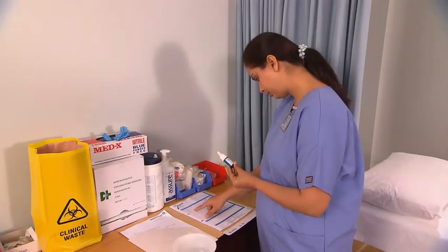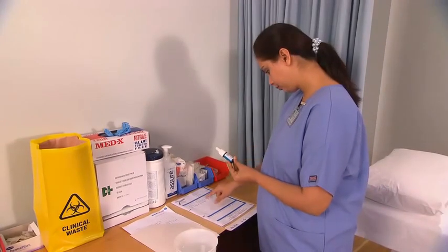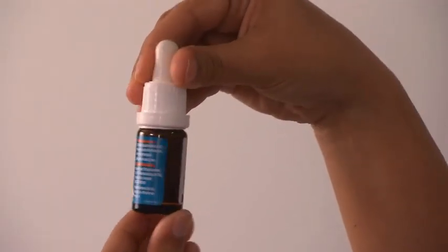Perform the first medication check against the physician's order. Check the medication name, the dose, and the expiration date. Inspect the medication for crystals, lumps, or any discoloration, and ensure the medication is clear.